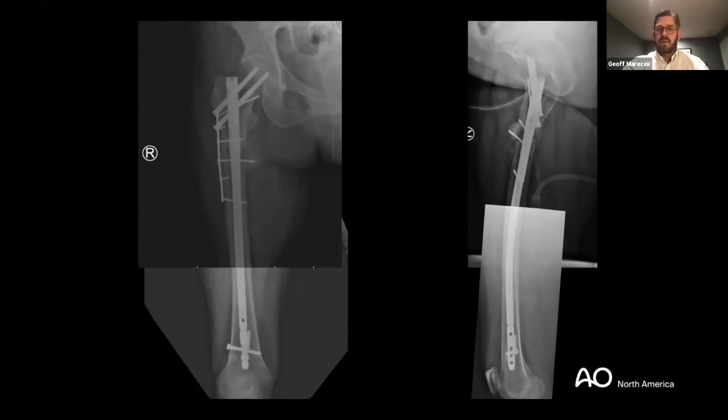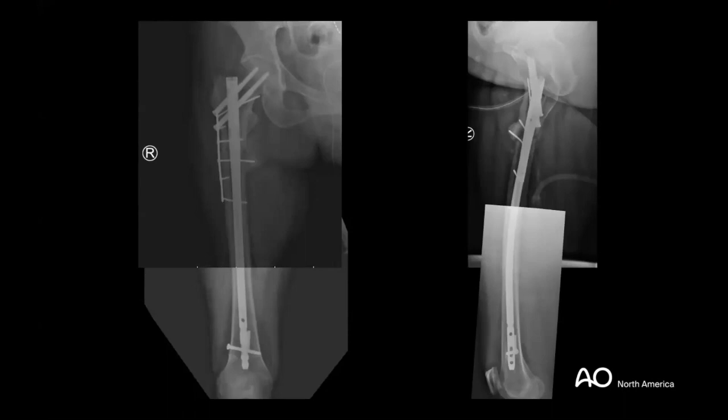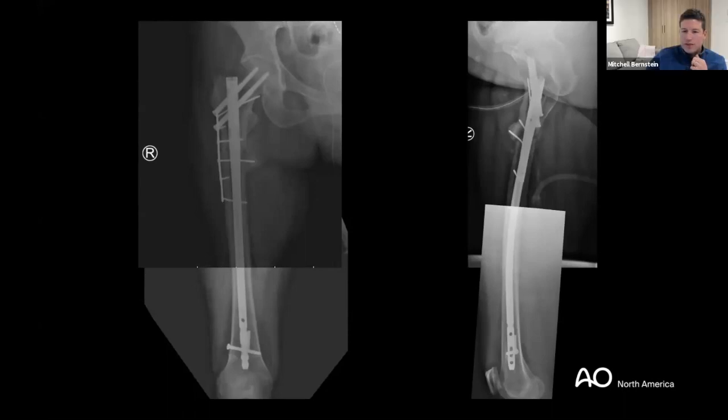No, I mean, I think the Z effect is real, but it's also, again, somewhat historical because we've learned to leave our proximal screw shorter and try to avoid that. So if your caudal screw that's more medial is longer, you should be able to go from there. And yeah, Ed, do you want to comment? Because you also mentioned an inner troch versus a subtroch, right? That comment. Yeah, a couple points.